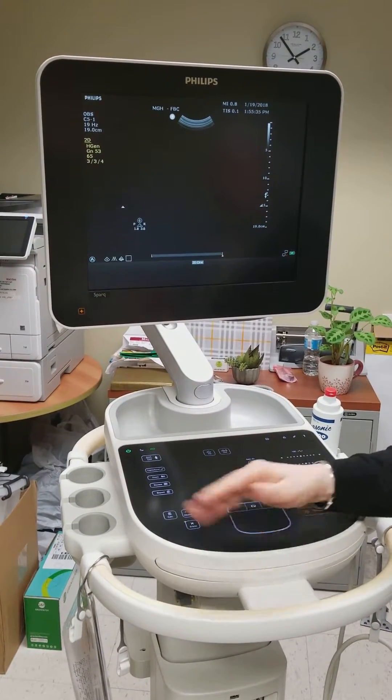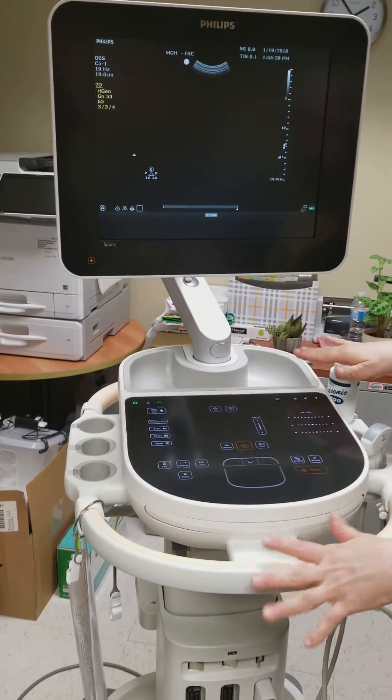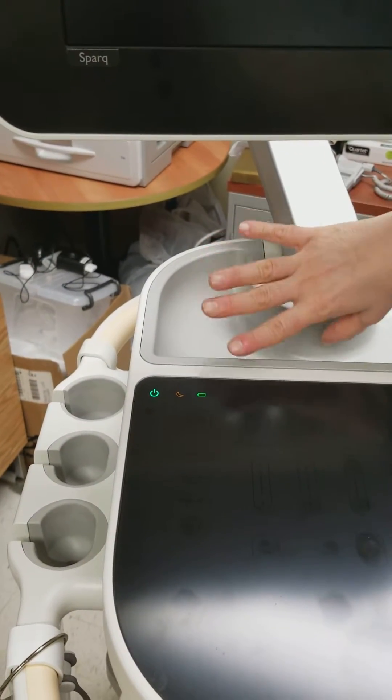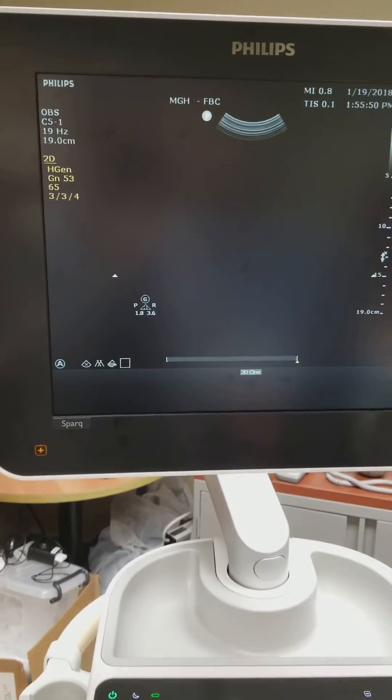Just move this little fluffy thing off of here — you're going to be seeing it lit up like that, but we're not going to be leaving it like this all the time when it's not in use. You're going to be using this button here — it looks like a moon. When the unit is asleep, the moon is yellow, and then just touch it and it'll come back up.